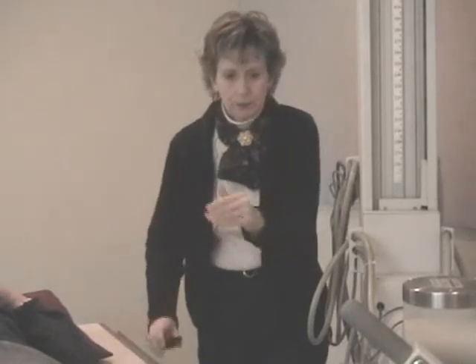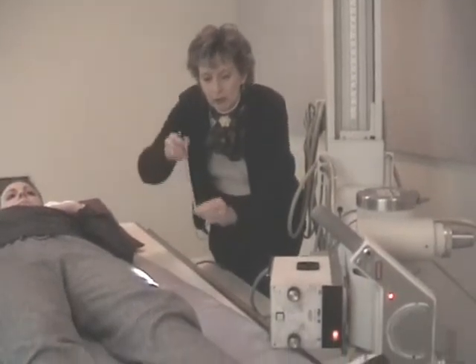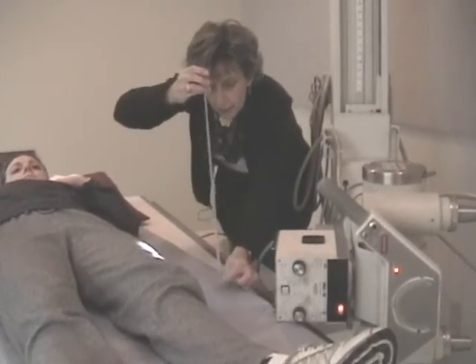Okay. You're first learning, and you're still on your recipe card. So we've shown you this with an abdomen series, but I'm just going to try to mock it here.